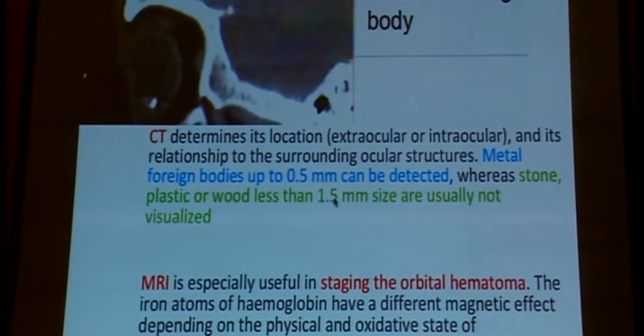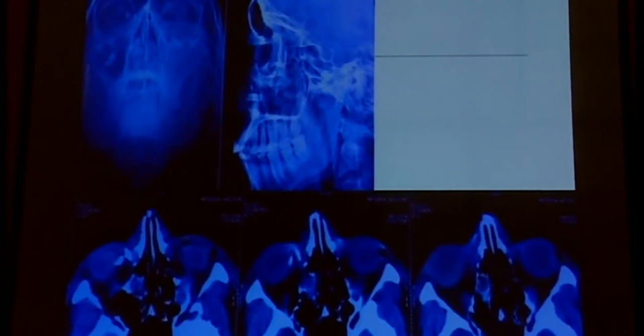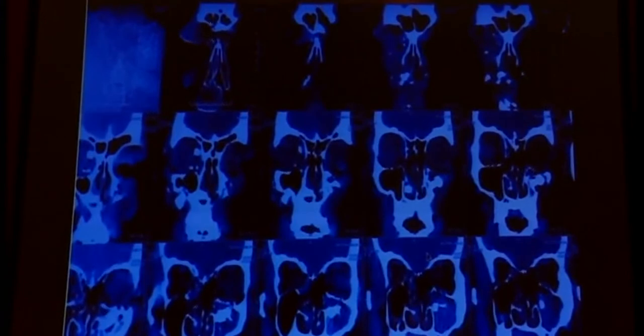Foreign bodies can also be picked up if you don't have access to a CT scan and it's a closed-globe injury - you can get an X-ray done and then do an ultrasound and have a look around. But if you want to see the exact relation and want to remove the foreign body and see the structures adjacent to it, a CT scan gives a much better idea. MRI is not required in every trauma case. However, if you want to stage an orbital hematoma, especially in medico-legal cases, an MRI is far more useful. We saw a case where the residents ordered X-rays, saw something, then got a CT scan done - and you see there are so many things that had been missed on X-ray: multiple foreign bodies and multiple fractures.